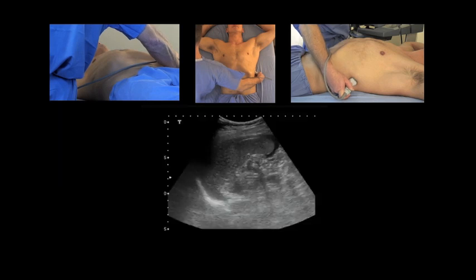This is an example of free fluid in the left upper quadrant around the spleen. So one of the places we often see free fluid around the spleen is around the lower tip of the spleen here. You can see a black cap of fluid around that lower tip there. And the other place is below the diaphragm here, which is not present in this patient.